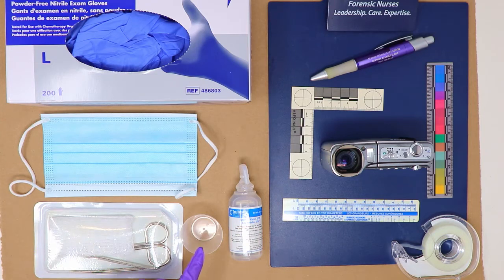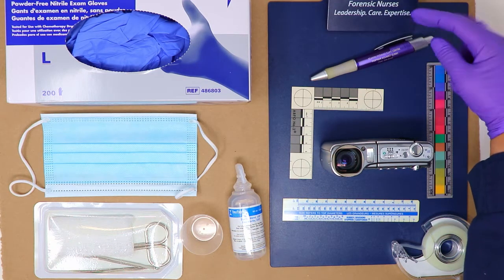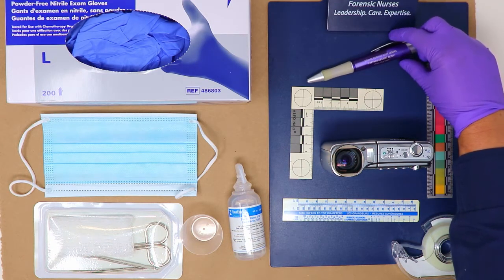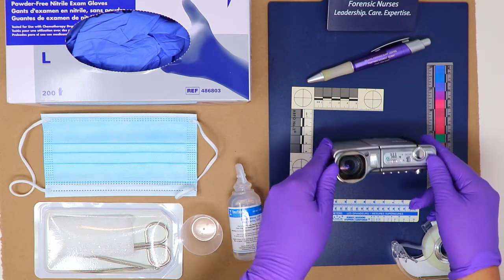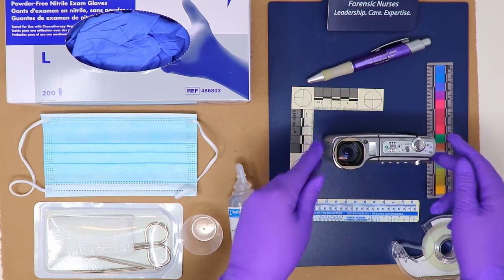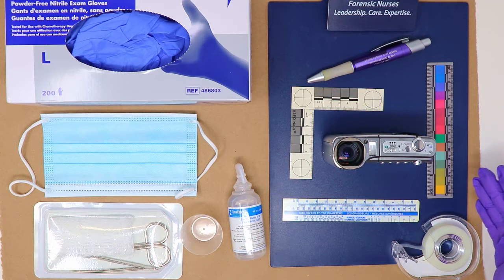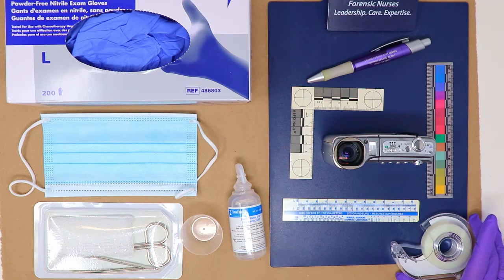A medicine cup and sterile water will be used throughout the examination process in the collection of skin swabs to moisten the swabs in advance of collection. A clipboard should be used to take notes and firm pressure applied using a pen. A camera can be used to document any injuries. Any photographs should be taken with the use of a ruler. Tape may also be required as it can be used to seal evidence packaging.